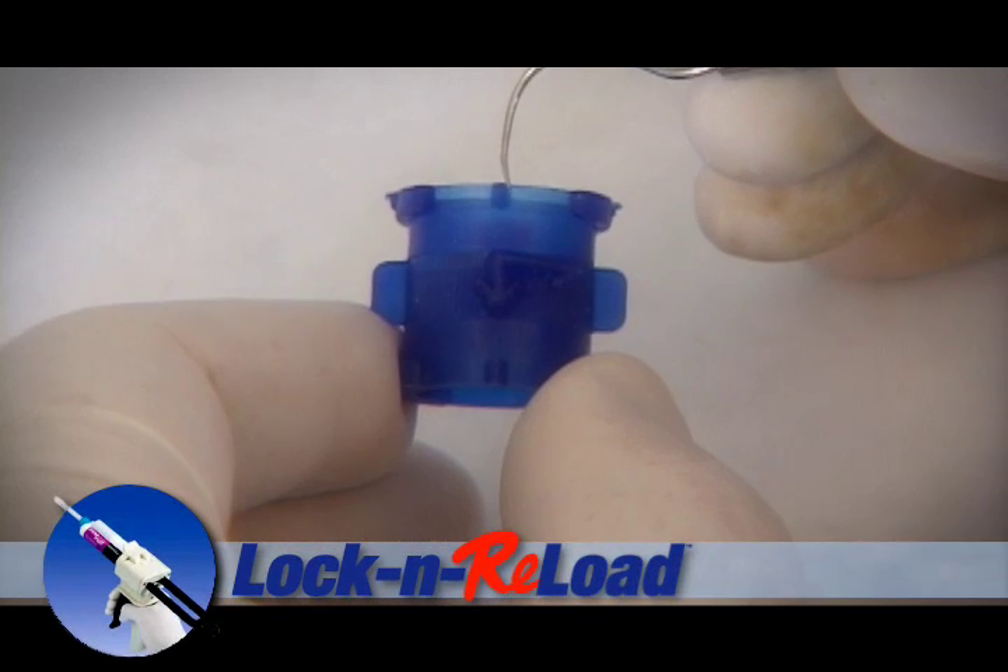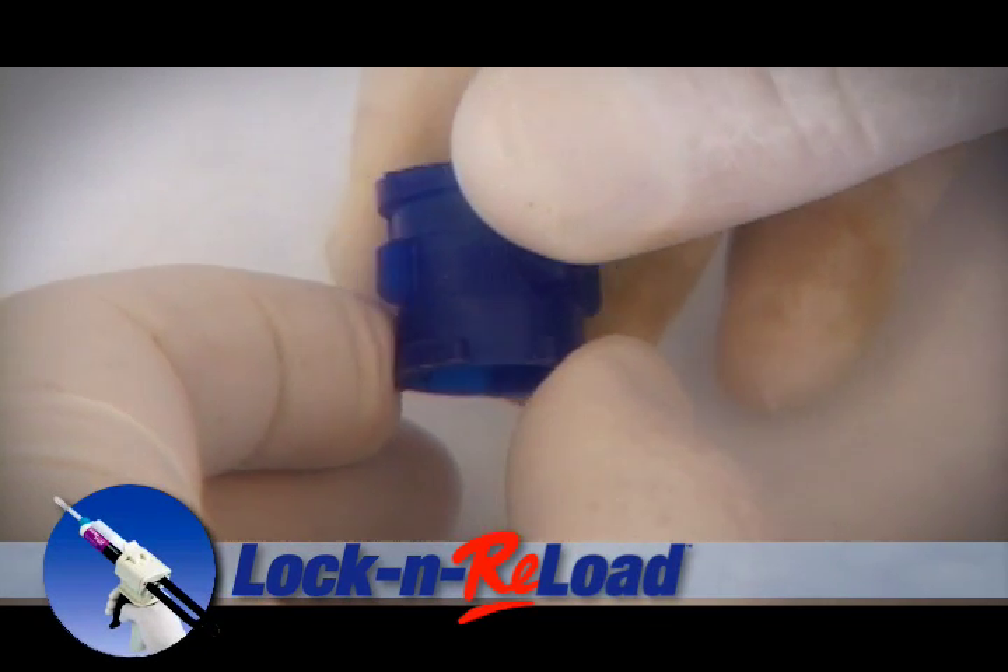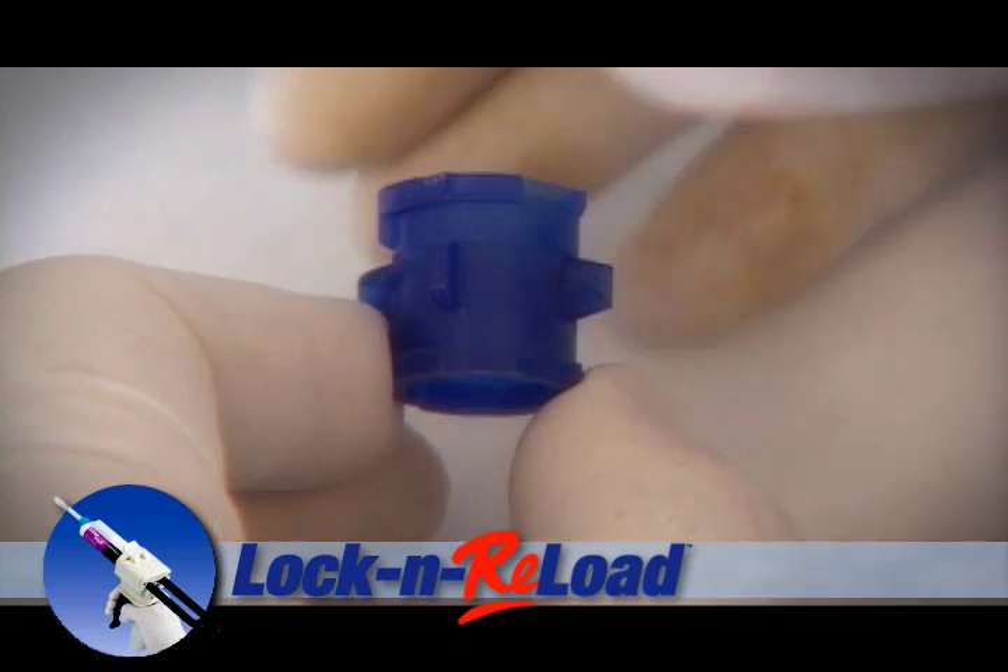Once the two cartridges are coupled together, you turn the tab in the direction of the arrow and it will lock the tubes in place so they can't come apart.